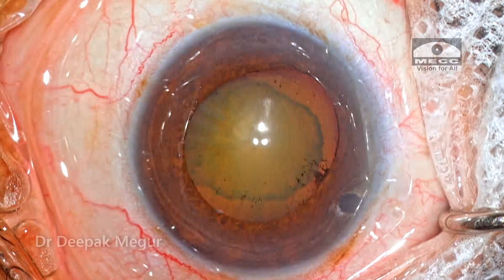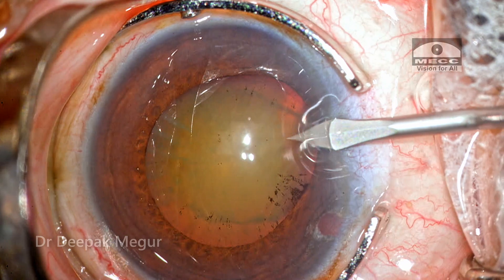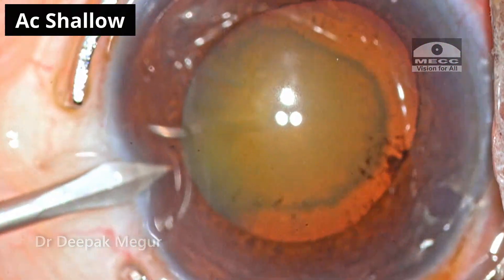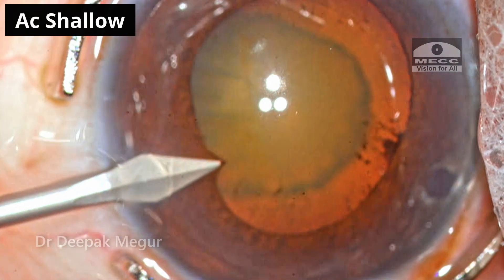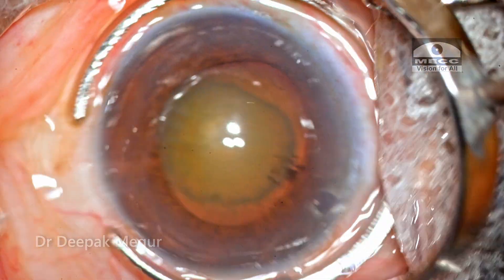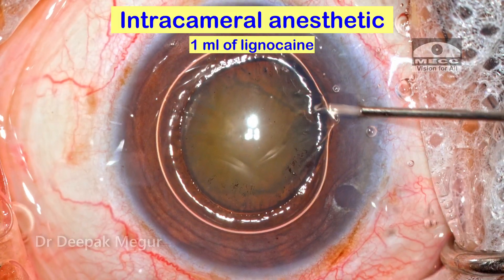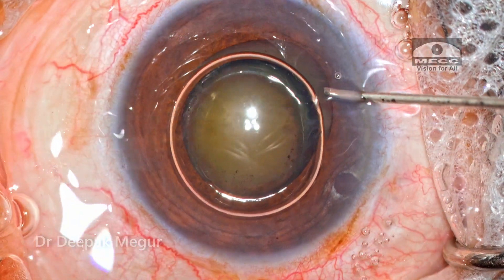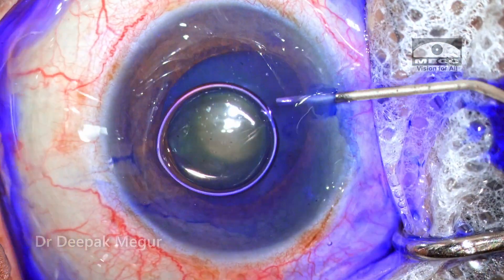Let's try to understand a few of the challenges we may encounter during this surgery. Surgery is being done under topical anesthesia. As I'm doing the side port, we can see that the blade is grazing across the iris, suggesting the shallowness of the anterior chamber. This is a case with angle closure disease as well as pseudoexfoliation, and the chamber depth is also not very good.